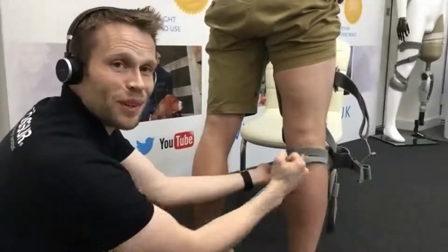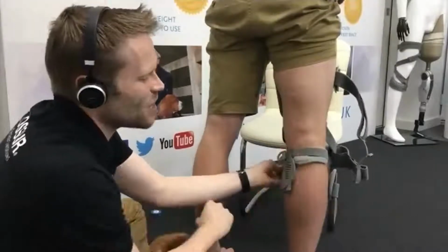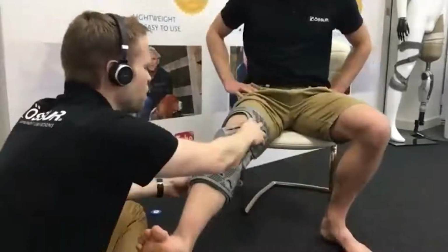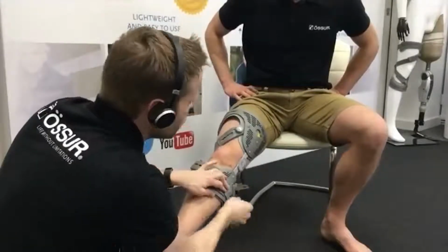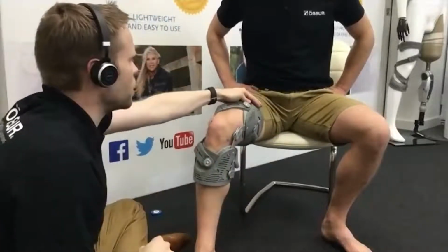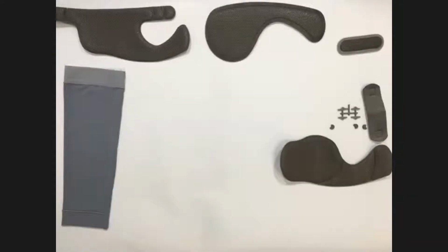I need to make a small adjustment to my gastroc strap. That's a little bit out of position there, but you can see that that's holding that in position there. So we're getting another method of suspension, and we then fit the brace exactly as we would have done before. Now, one of the last accessories we need to talk you through, just do the last few steps with this, is the sleeve. So we're going to go back over to the table and just talk you through the sleeve.